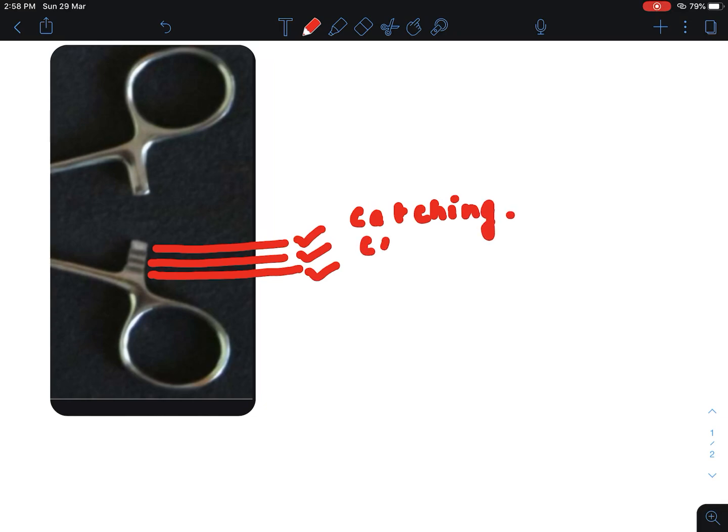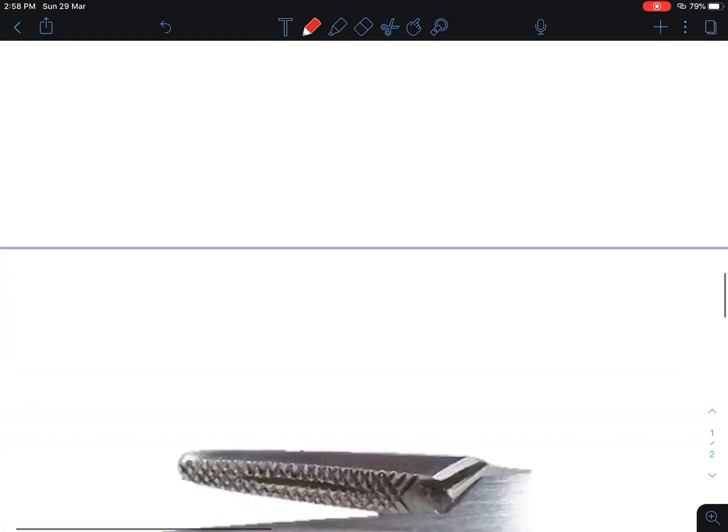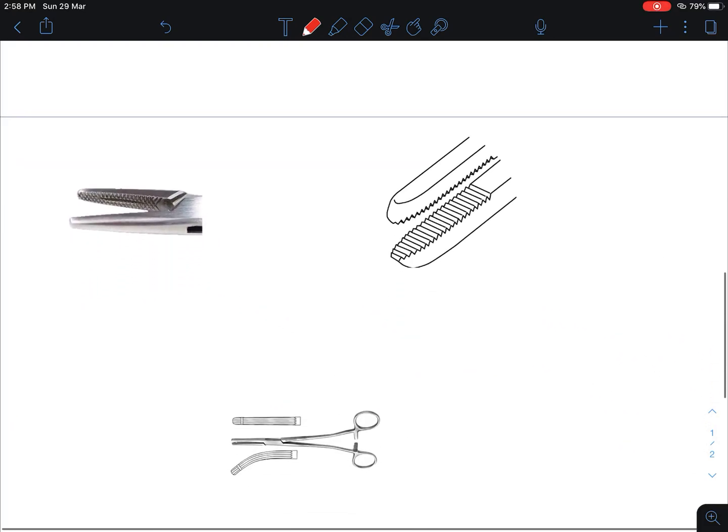I want to discuss more about this ratchet or catch. You can see the parts of the catch — there is the first part, the second part, and the third part. The first part of the catch is used for catching the tissue, the second part is used for clamping the tissue, and the third part is used for crushing the tissue. When the catch or ratchet is pressed, the blades are held in the closed position.